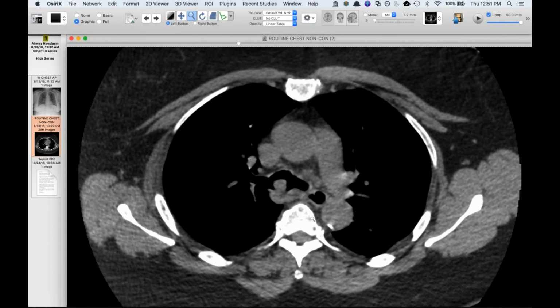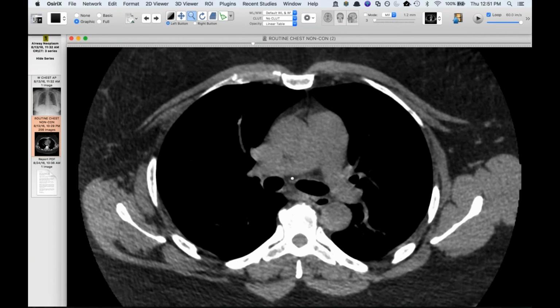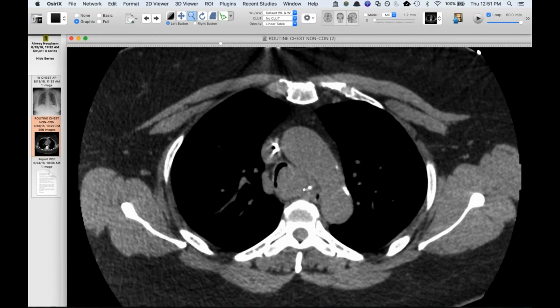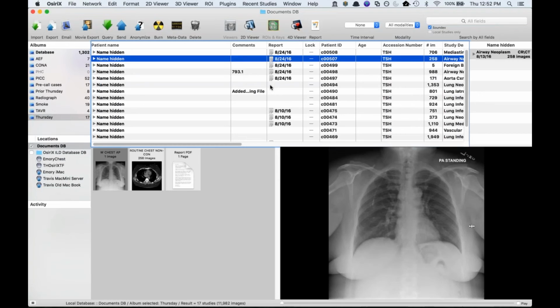And I found a case that I don't have on my local machine, but I think Jacobo was the one that showed it 3 or 4 years ago. It was very similar to this, and it turned out it was cervical cancer that had metastasized and invaded the trachea as well. So now we've covered primary lymphoma and metastatic disease of the trachea today. So it's a good coincidence, right?